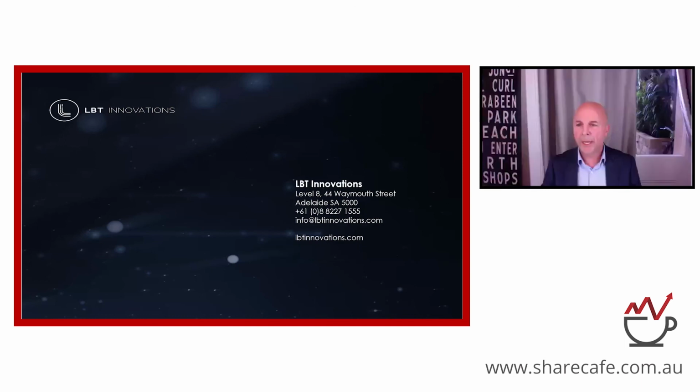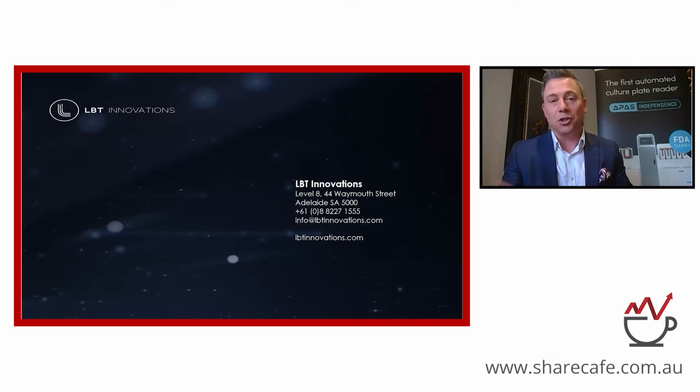Right. And one last question here. How accurate is the equipment compared to what was done previously? Yeah, so the predicate, it's a really good one. So the predicate's a human, right? So part of our 10,000 patient clinical trial was having 3 blinded microbiologists look at 10,000 patient samples. We had to have 3 because they didn't always agree with each other, but 2 out of 3 would. So that became our truth statement that we then ran that same 10,000 plates through our APAS instrument and had over 99% sensitivity. And that formed the basis of getting our FDA clearance.